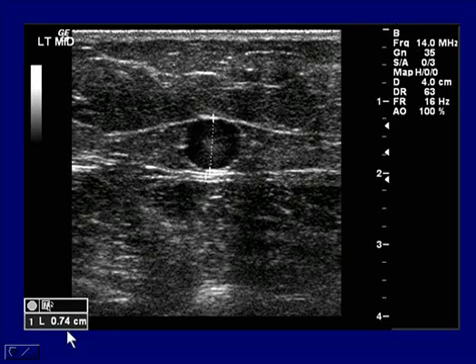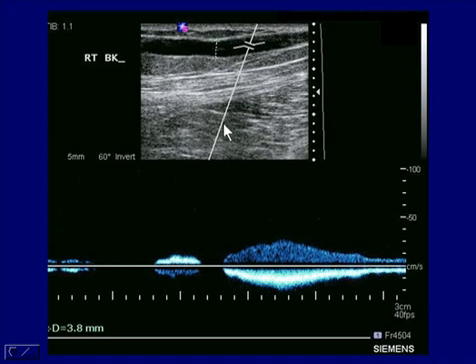The other thing I note here is vein diameter. In this case, it's 7.4 millimeters. This used to be important in determining the size of catheters that some physicians use for ablation procedures. However, it's not quite as important, but some insurance companies want that information. So you may still be required to measure vein diameter in the superficial system if people are undergoing ablation techniques, which we'll talk about in a minute.